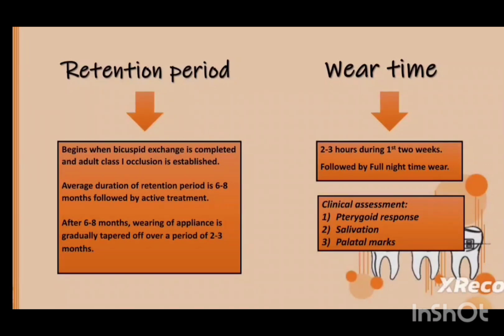Now, as it is adapted in that particular direction, after the continuous wear of the appliance, when you take your mandible backwards, there is a pain felt behind the condyle, and this is known as pterygoid response. You can check for it.